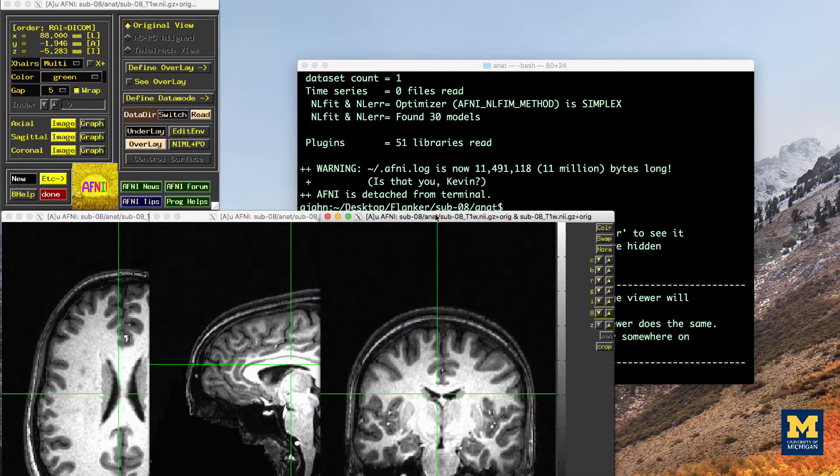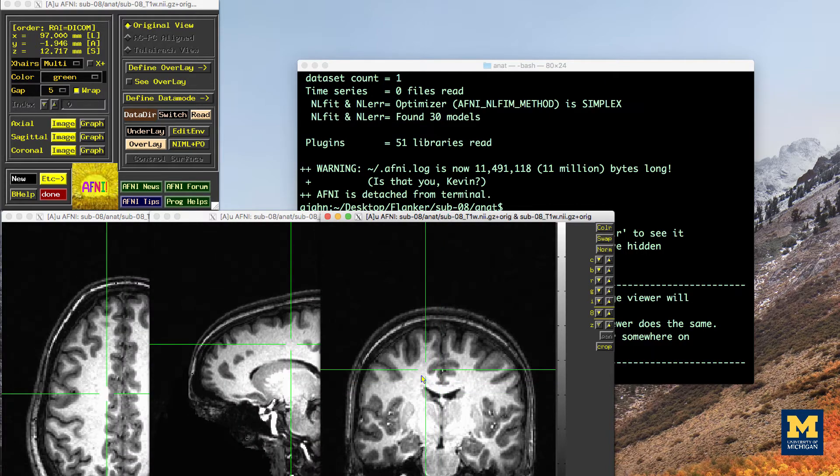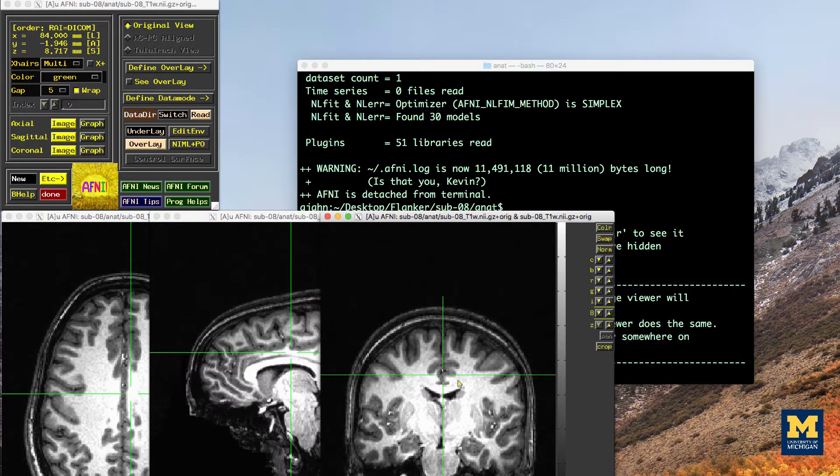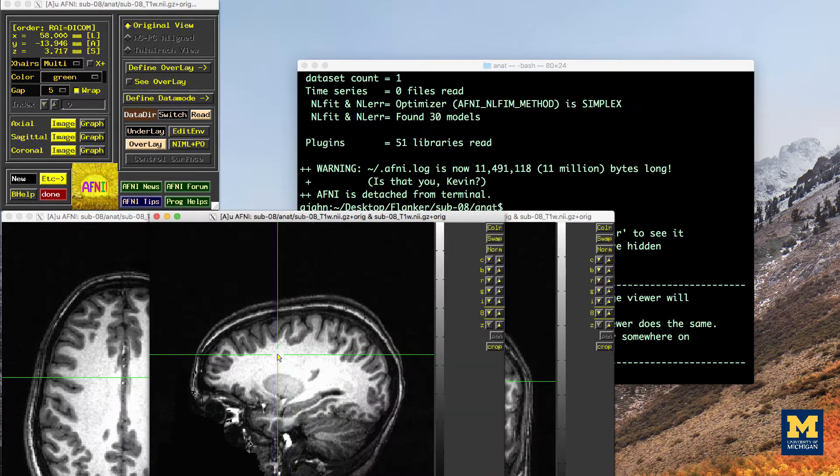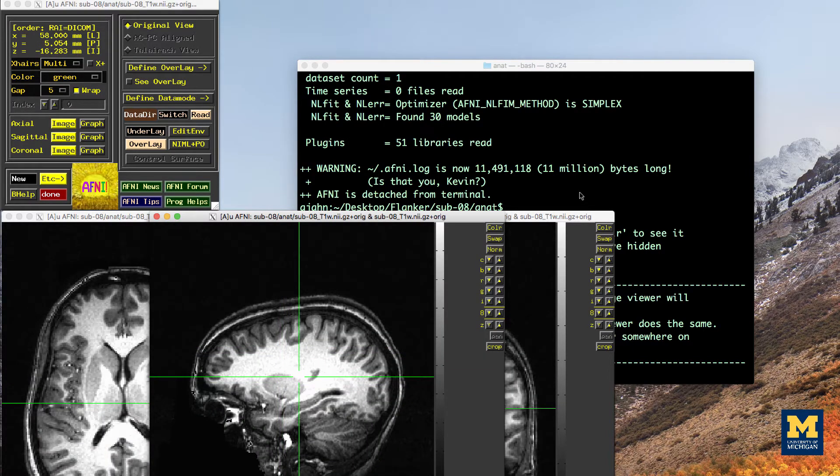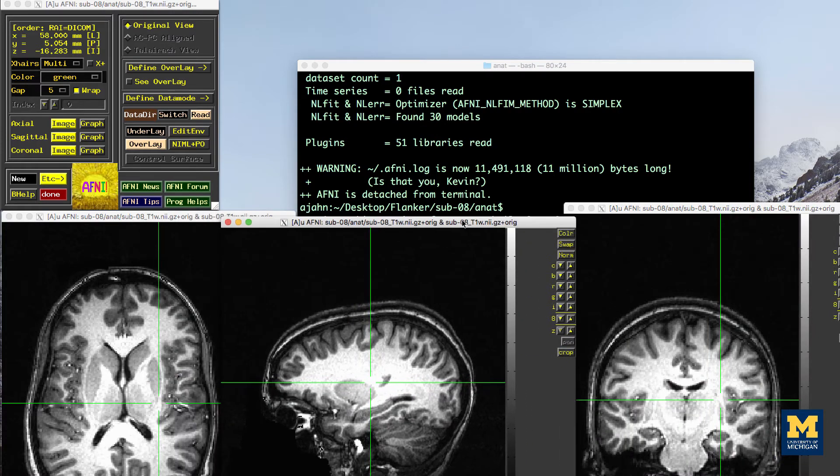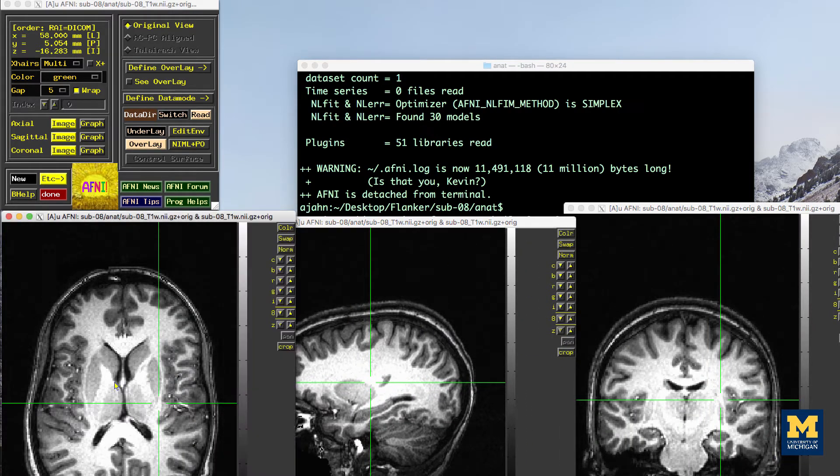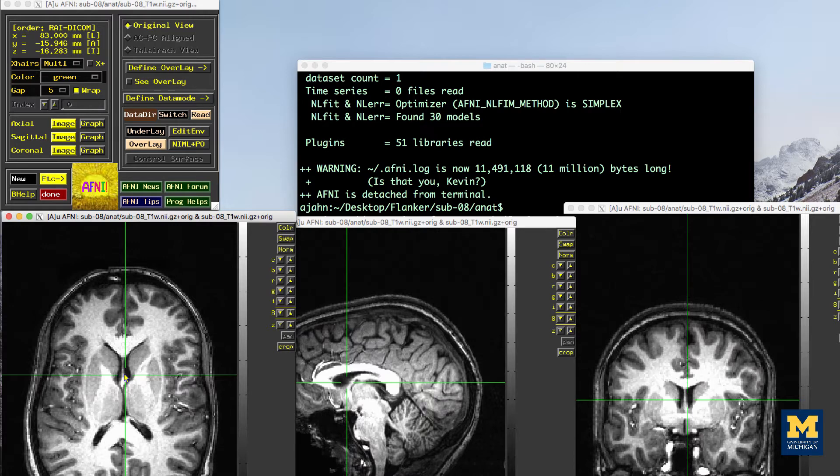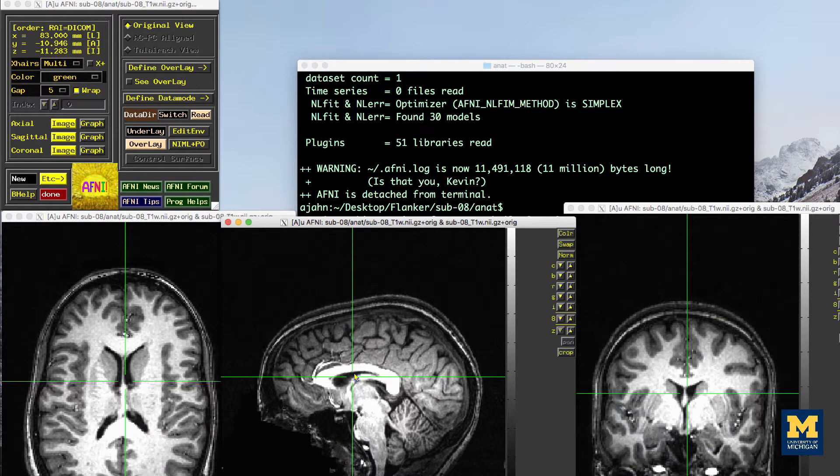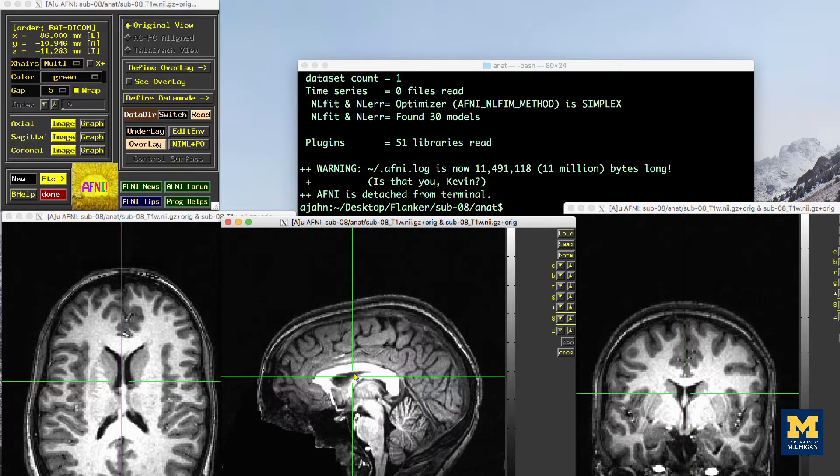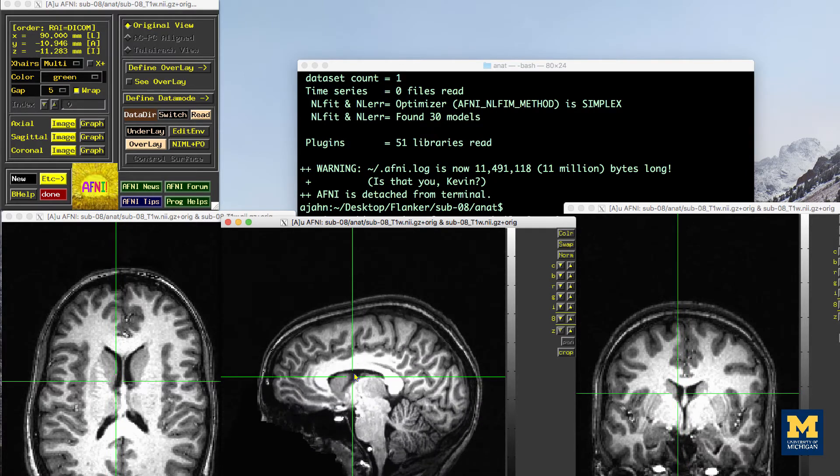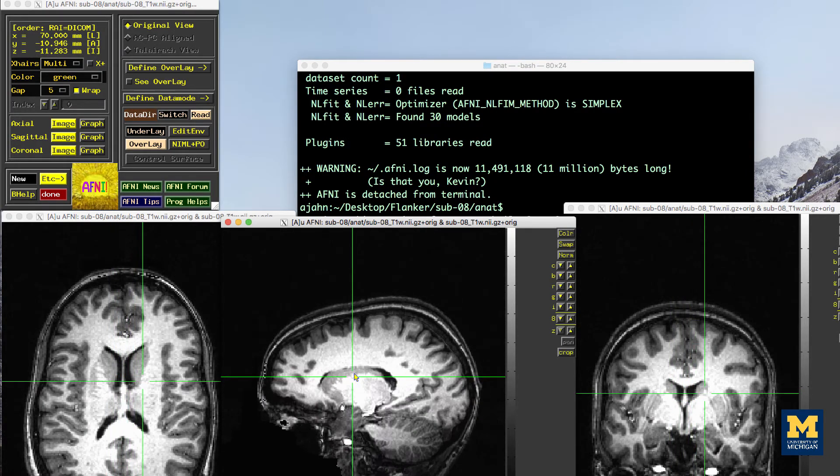Inspect the image by clicking around in one of the viewing windows. Notice how the other viewing windows and crosshairs change as a result. This is because MRI data is collected as a three-dimensional image, and moving along one of the dimensions will change the other windows as well. If you have highlighted a window by clicking on it, you can scroll continuously through that viewing plane by using the mouse wheel to scroll up or down.